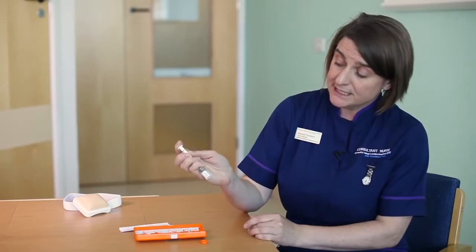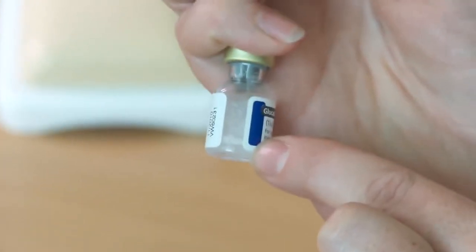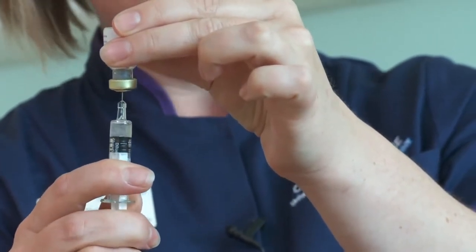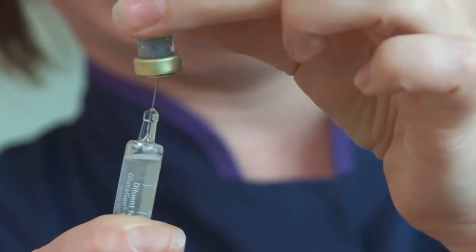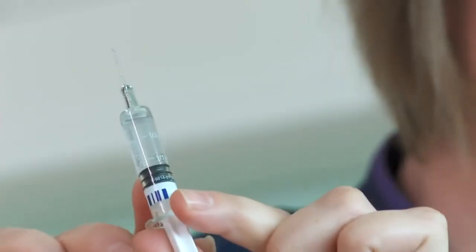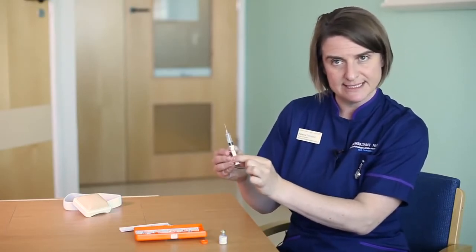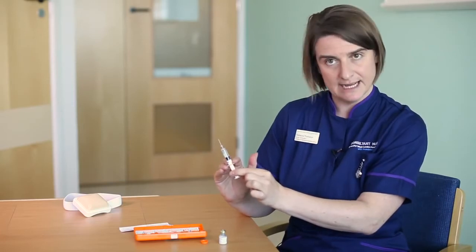What you're looking for is that all of the fluid in the vial is clear — it should look like water. Once you can see there's no powder left, it's ready to go. Inverting the syringe, I'm going to draw up all of the fluid from the vial. Once I've got all of the fluid, I'm going to take the vial off the syringe. You don't need to worry about air bubbles for this. This isn't going to be given into a vein — it's going to be given into the muscle — so that's absolutely fine.